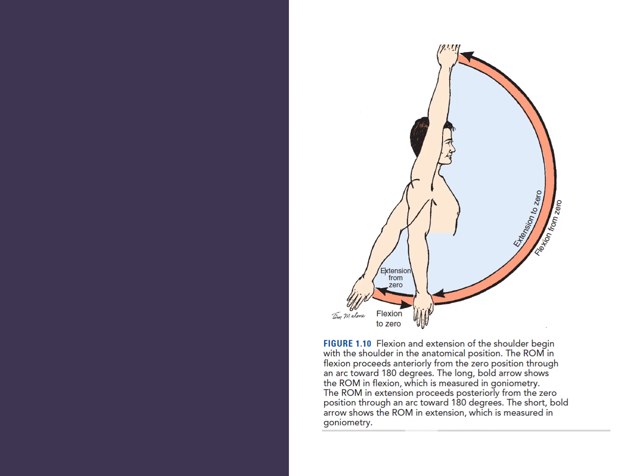That means you're going from 0 to 180 degrees. Now the last position of your arm was 180 degrees, so from there, when you take it down, it goes to 0 degrees. So 0 to 180 degrees is one system, and 180 to 0 degrees is the second system.